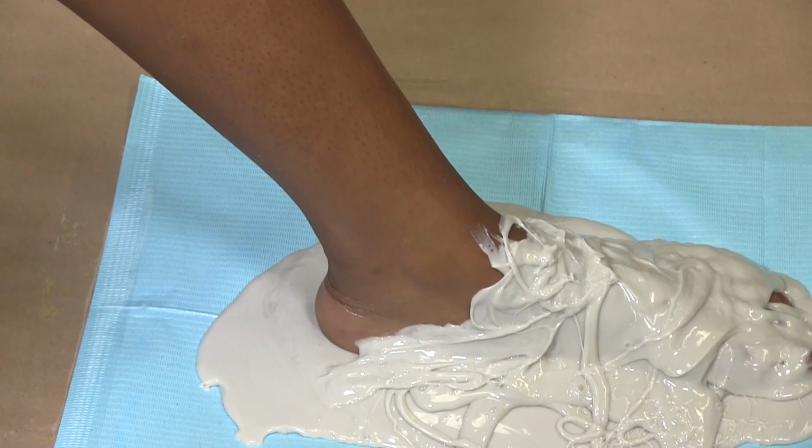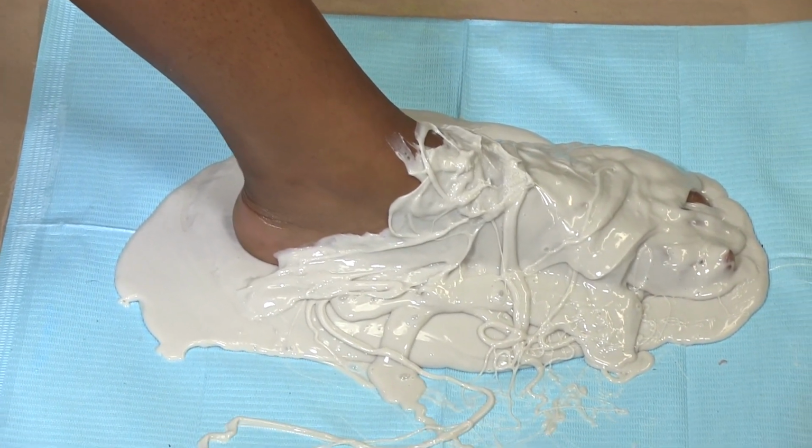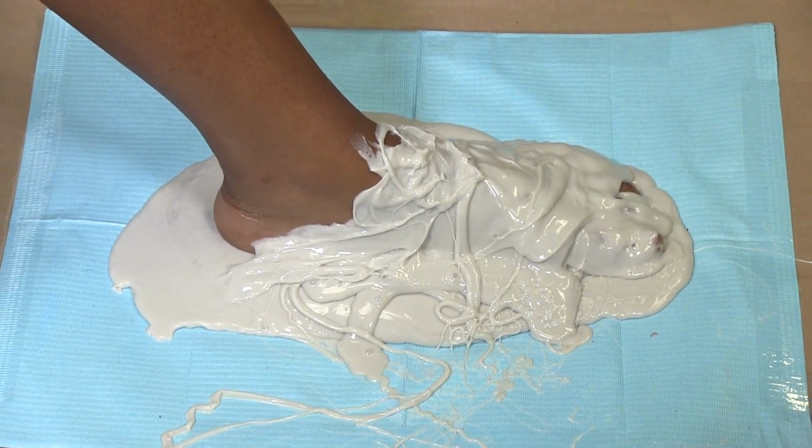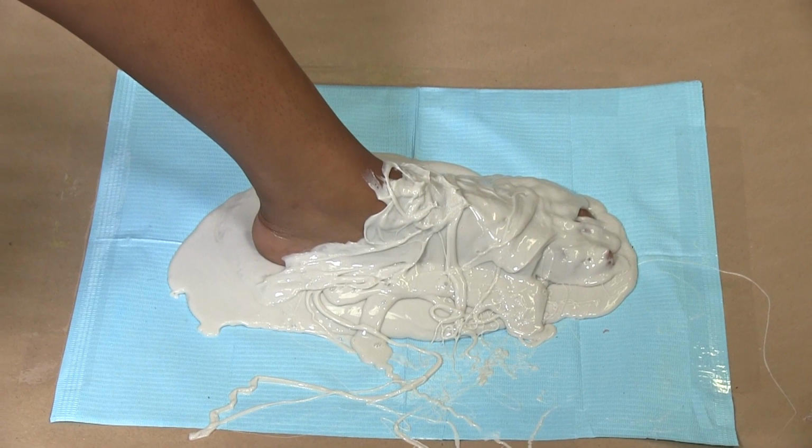Note the bad angle of the leg, exposed ankle, and holes and thin spots in this bad impression. Poor impressions like this will have to be remade and will delay the creation of a livingskin prosthetic.